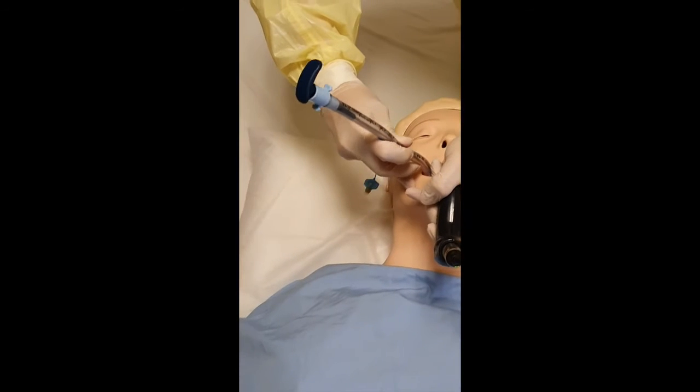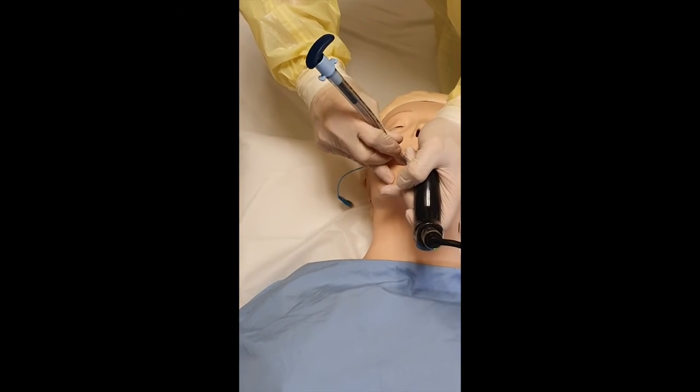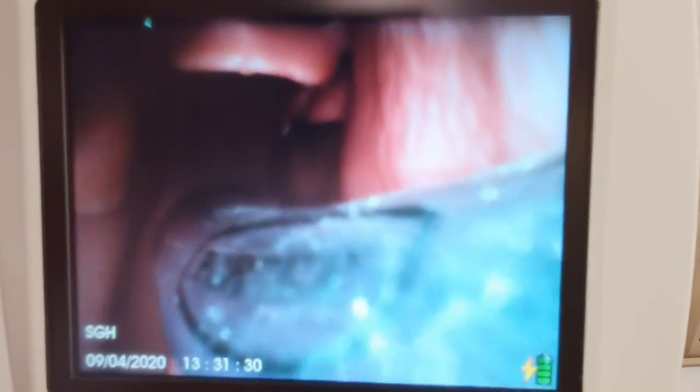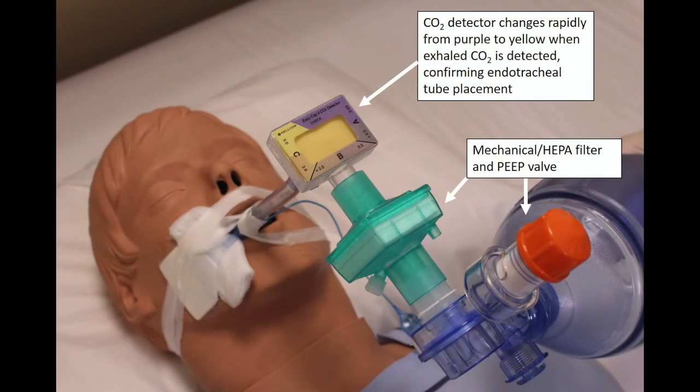Here we are demonstrating intubation with the GlideScope and use of a rigid stylet. Notice that the stylet will need to be withdrawn first before the rest of the endotracheal tube can be advanced past the vocal cords. This is also illustrated in this video here. The video laryngoscope is being introduced into the oropharyngeal space and the vocal cords are visualized with the tip of the blade in the vallecula. The endotracheal tube is introduced and once it is beyond the vocal cords, notice that it cannot be advanced further. The rigid stylet is now being removed and then the endotracheal tube can slide in smoothly until the horizontal line of the endotracheal tube is approximately at the level of the vocal cords. A CO2 detector can help to confirm placement by a change in color from purple to yellow, indicating that exhaled carbon dioxide is being detected.